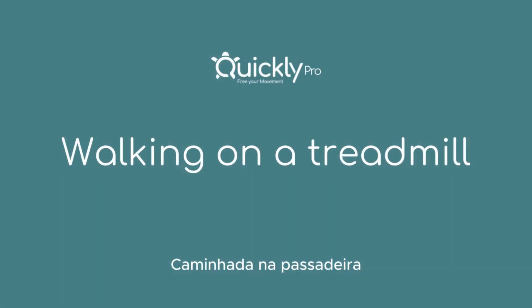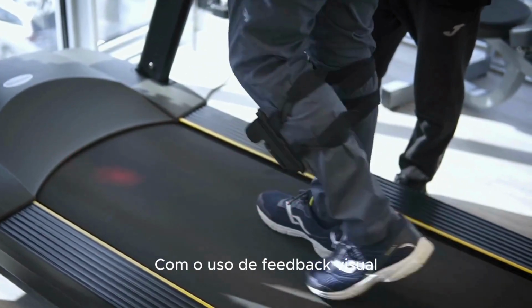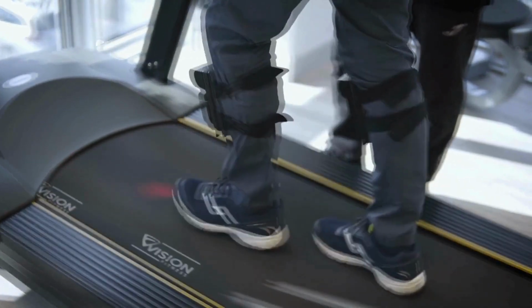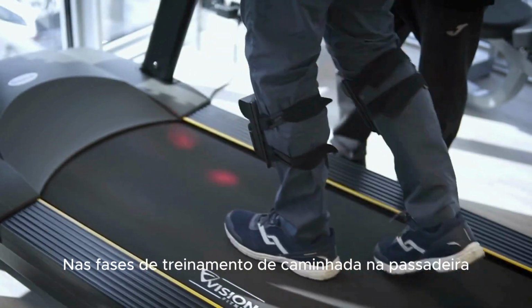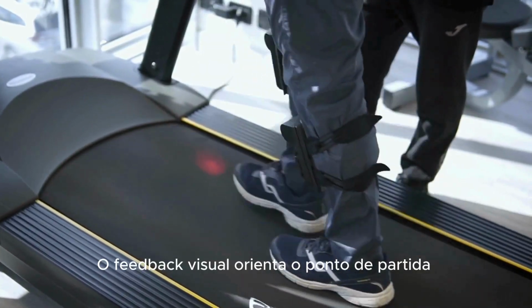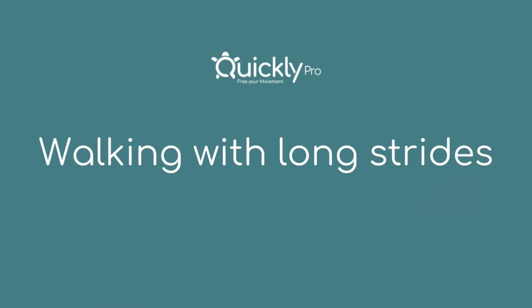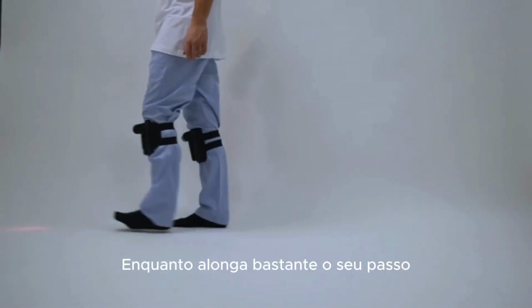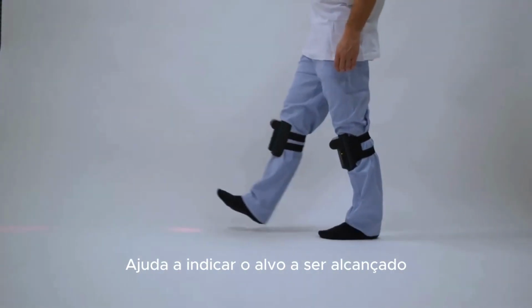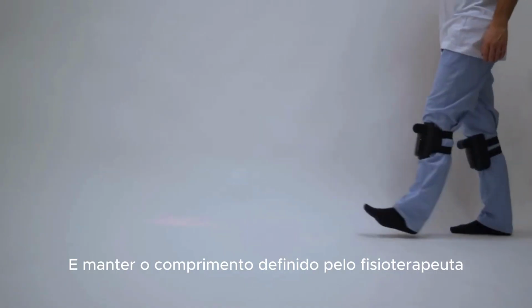Walking on a treadmill. The exercise involves walking on a treadmill with the use of visual feedback. This training can be very useful in the phases of walking training on a treadmill. Visual feedback guides the foot's point of walking with long strides. In this exercise, the patient is asked to walk while lengthening his stride a lot. Visual feedback helps to indicate the target to be reached and to maintain the length set by the physiotherapist.